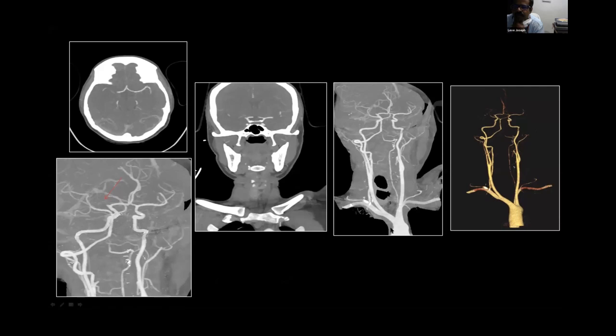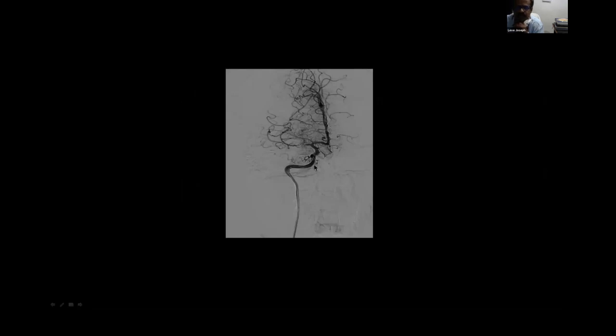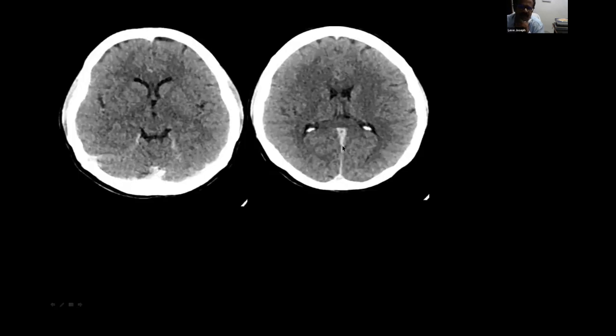Coincidentally, it will give other information about the arch, the status of vessels. You can see in the young patient, every vessel is straight, no tortuosity. The interventionist would be happy to see such an arterial system. Okay, we went ahead with the angiogram. As expected, M1 occlusion is there. After one pass of Solitaire, this was the final result. Patient went home with almost no infarct, no deficit, complete recovery. So the site of occlusion can be confirmed instantly by the CT angiogram.